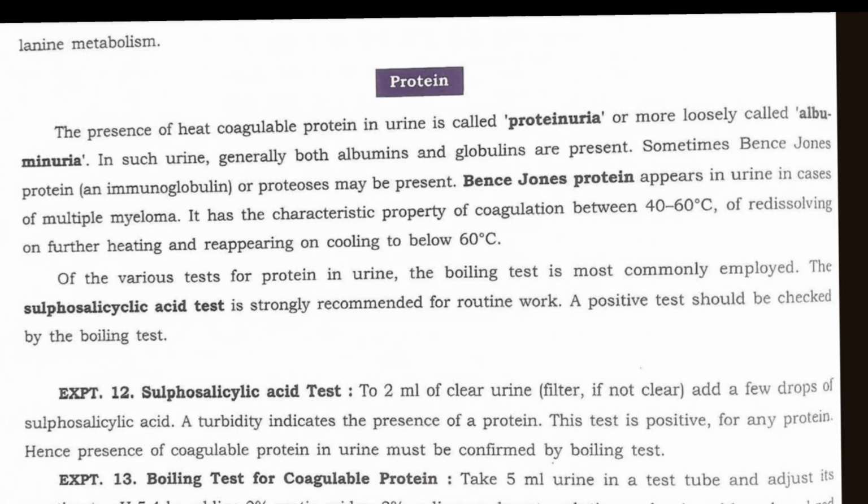एक टर्बिडिटी indicates the presence of protein. This test is positive for any protein, hence presence of coagulable protein in urine must be confirmed by boiling it.